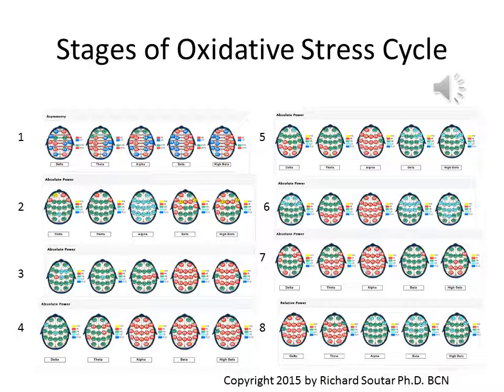I propose that we can describe most maps as reflecting a stage in an ongoing oxidative stress pattern that generates progressive neuroinflammation. For example, in this particular snapshot we have in front of us, we can see a progressive sequence of degradation of neural functioning starting in stage 1 and working all the way through stage 8.